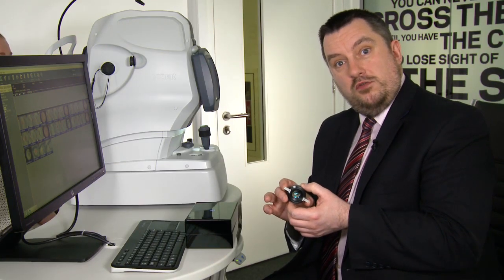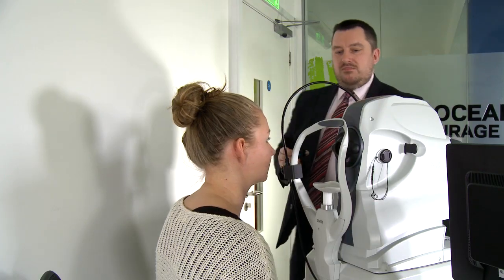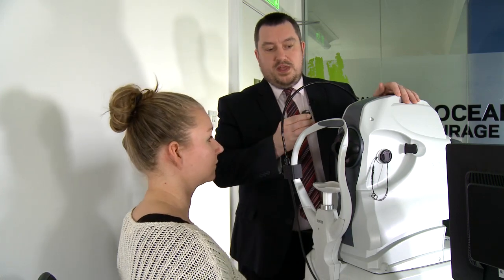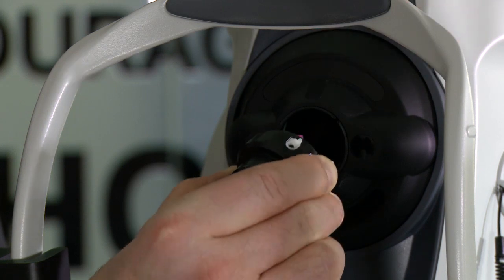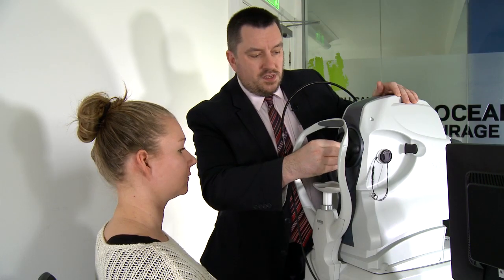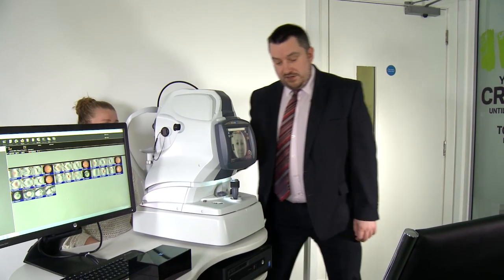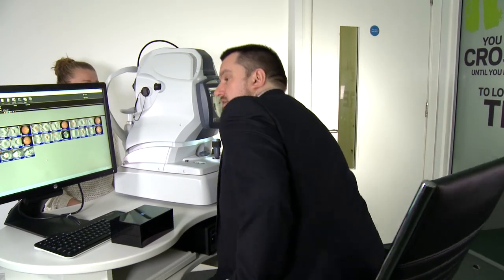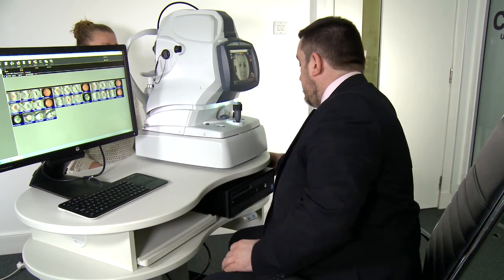So we're going to now attach the anterior module. I'll show you how to do that now. So now we're going to put the anterior module in place. So we line this notch up with the one on the OCT device, holding the calipers closed, then we let them open and they will grab, and now the lens is securely in place. So now that we've attached the anterior lens, we're ready to take some OCT scans. We'll just pop the box out of the way and ready to take some scans.